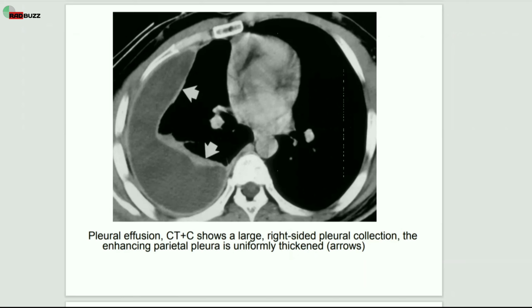And HRCT recon can be applied on a CT with contrast. So go for a CT with contrast, IV contrast, not the oral one. CT with IV contrast is superior to HRCT when going for pulmonary infections. We can reformat them with HRCT recon rather than going for an HRCT, which is without contrast, and you can miss so many things.